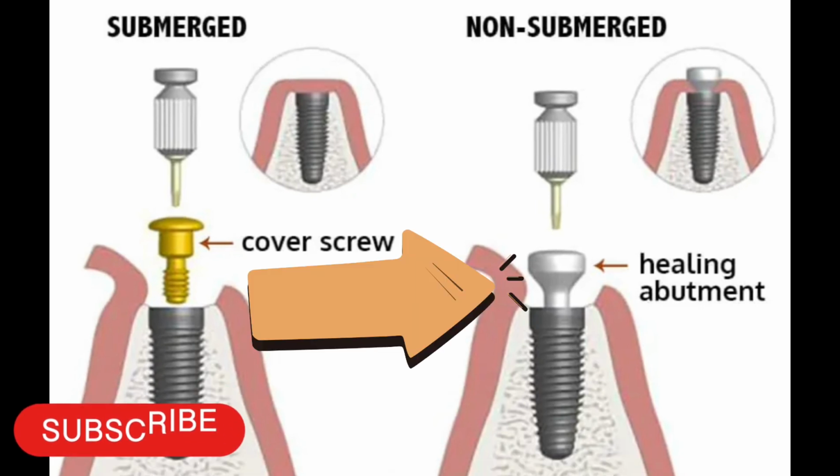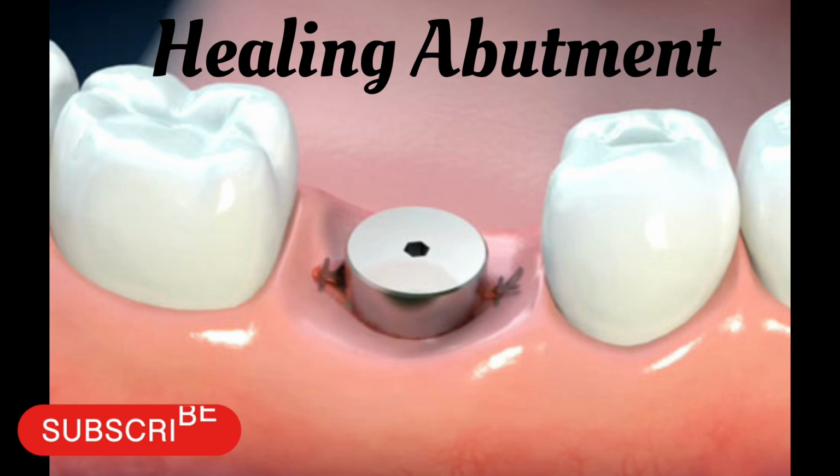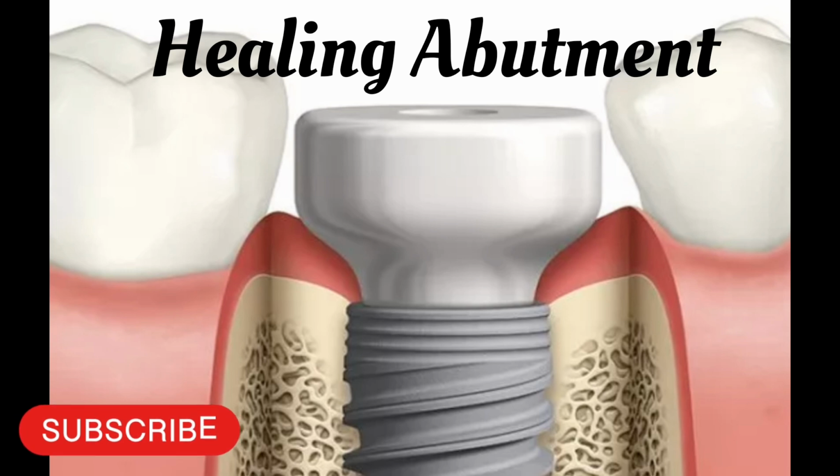On the right side you are able to see the gingival former, or you can say healing abutment. Healing abutment or gingival former extends the implant above the soft tissue and it results in development of permucosal seal around the implant. It is also called healing cap or healing abutment, and it is used for initial soft tissue healing.